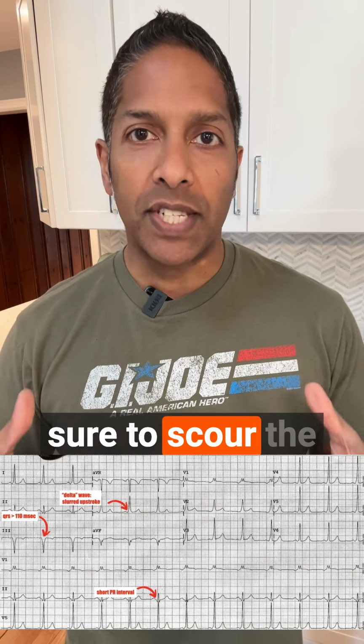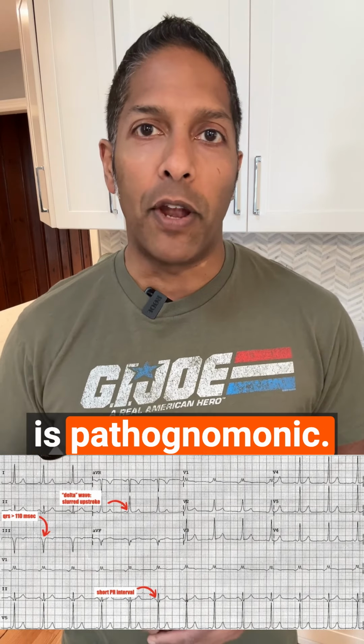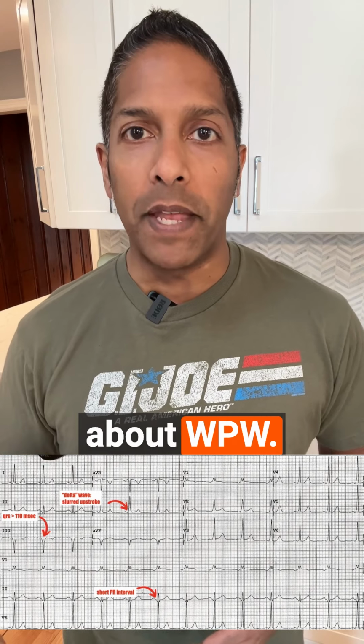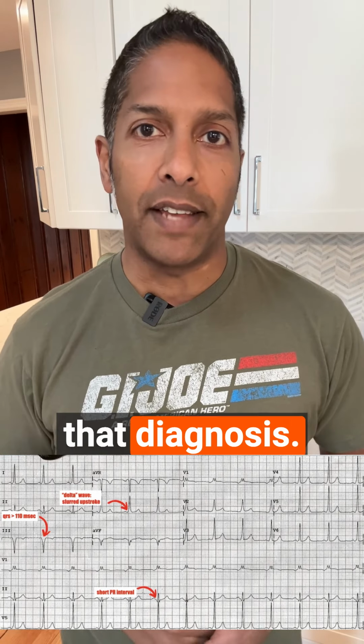So we need to make sure to scour the ECG looking for those delta waves, and that PR shortening really is pathognomonic. So in any patient where you see PR shortening, you should be worried about WPW. Take another look at that ECG looking for other features that would clinch that diagnosis.